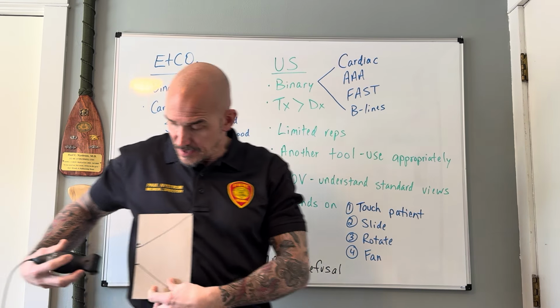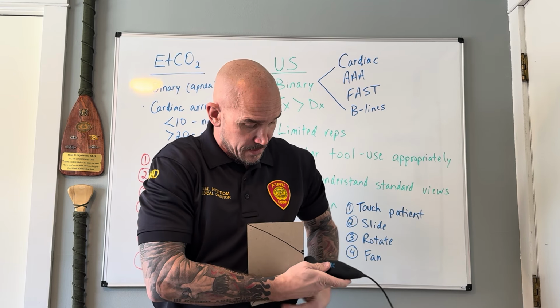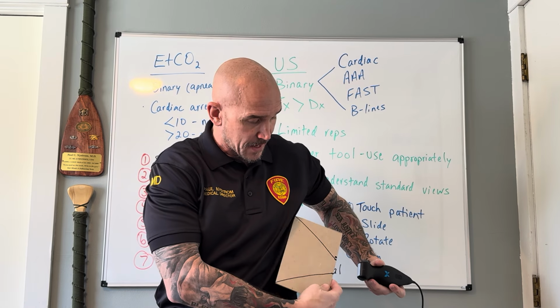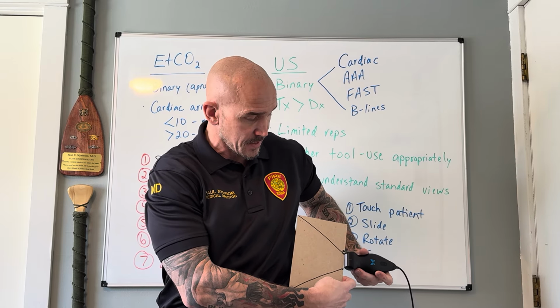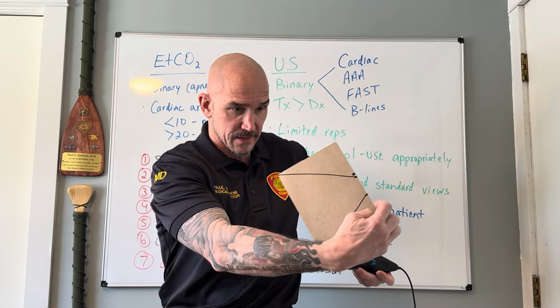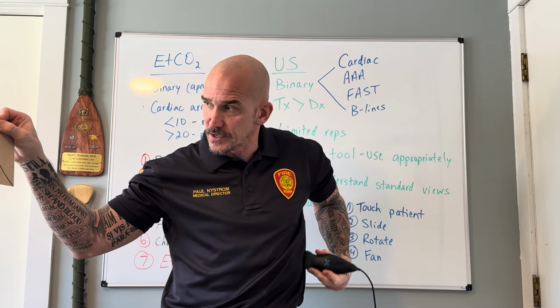So my FAST exam, I'm seeing a slice of this, right? When I'm actually looking, in a weird way, it's sort of like the back of your tablet, because when I look at trying to do a FAST exam over here, I'm seeing the back of the screen, right, on the tablet, which gets wonky because I'm looking at the screen over here, looking at the patient here, right?